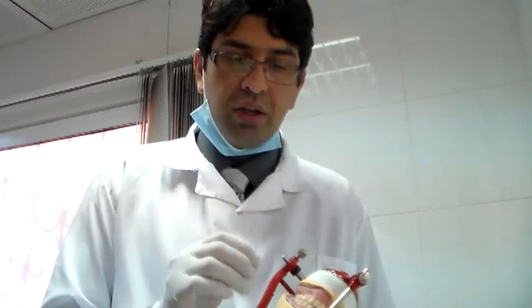Good morning. Today we are going to do a try-in procedure. We have to take our trial denture, and the first thing we have to check is the trial denture on the articulator. There are a couple of points that you want to check for on the articulator to make sure that the try-in is proper.